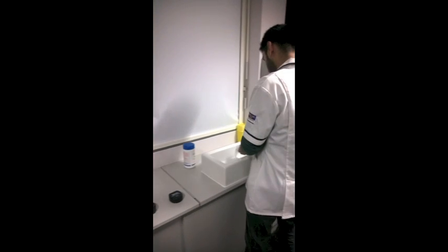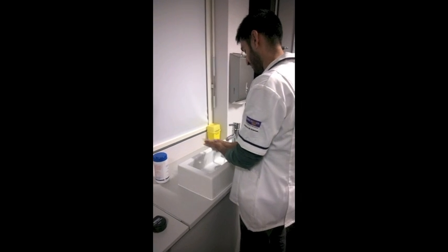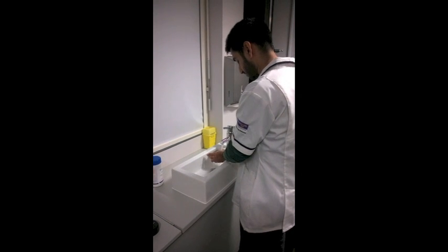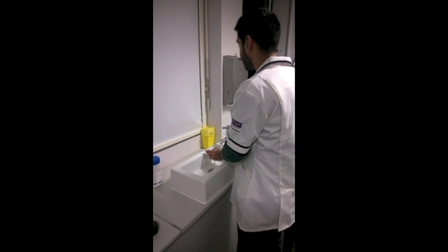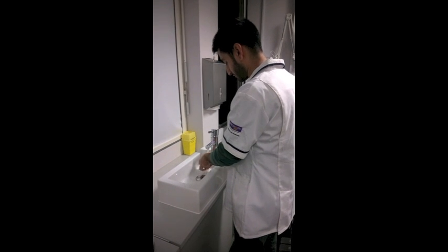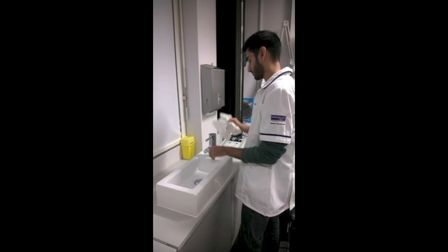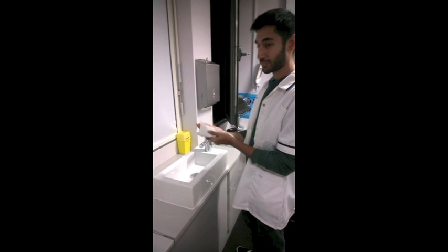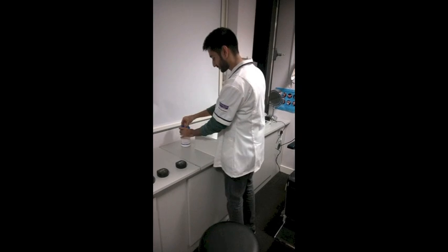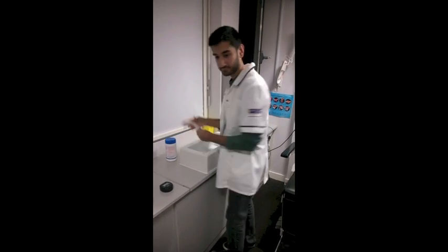With this procedure, hygiene is important to reduce the risk of iatrogenic infection. Your hands must be washed thoroughly and the headrest must be wiped down with alcohol wipes. Firstly, the patient's pupils must also be dilated. Although this process can be done on undilated patients, this requires experience, so when starting off it is better to dilate your patient. We must remember that there is the potential for dilation to cause angle closure. The anterior chamber angles and IOP should be checked before dilating the patient.